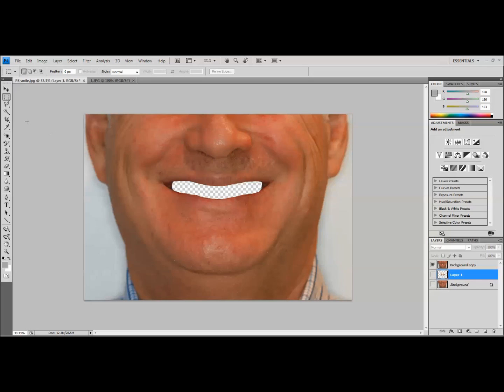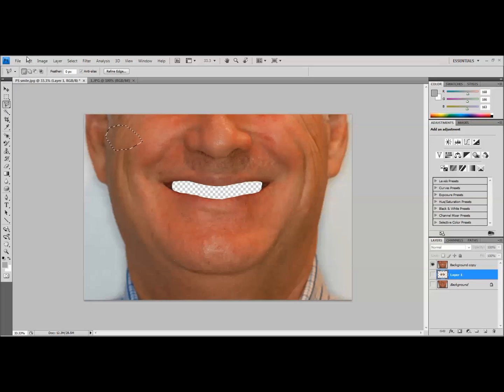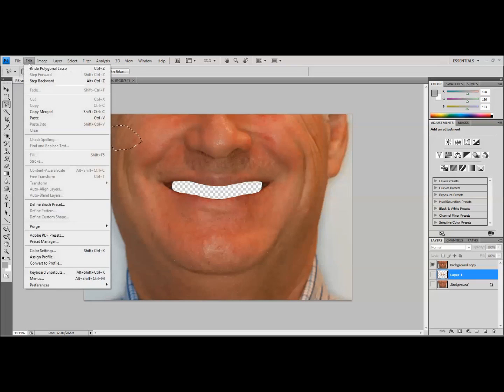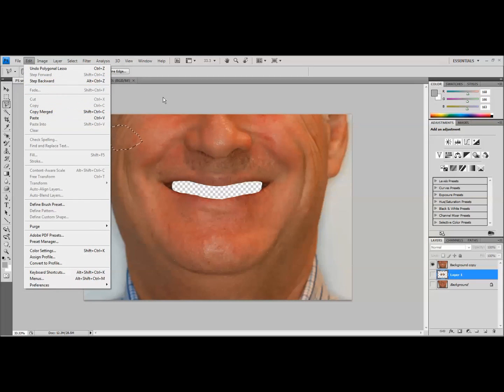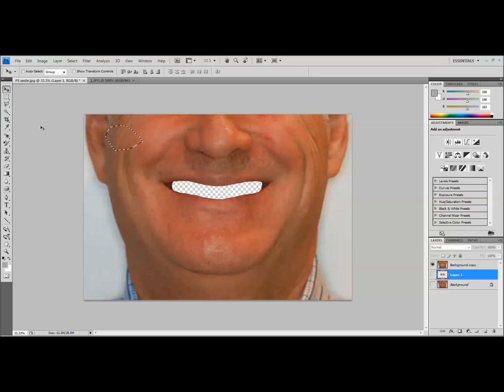The tool you would use to do that would be this lasso tool and you'll want to do the polygon lasso. The way this tool works is you're just going to go around clicking and you would just follow around within the patient's lips. And once it gets highlighted like that, you would come up here and say cut. Now, in his case, for the sake of time, I've already done that. So I won't go through that, but it's a very simple thing to do.